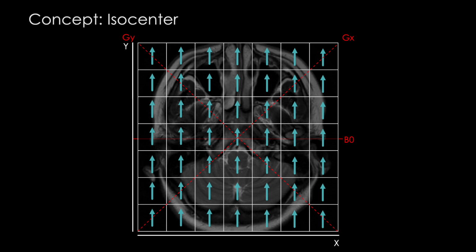So let's put the origin of our x-axis here, with x equals 0 being in line with our isocenter voxel, and accordingly, if we move to the left at this point, we will head in the negative x direction, and if we move to the right of this point, we'll head in the positive x direction. Same idea with the y-axis. We'll set our origin y equals 0 centimeters in line with the isocenter voxel, and if we move up from there, we'll be headed in the positive y direction, down will be the negative y direction. Is everybody okay with this?